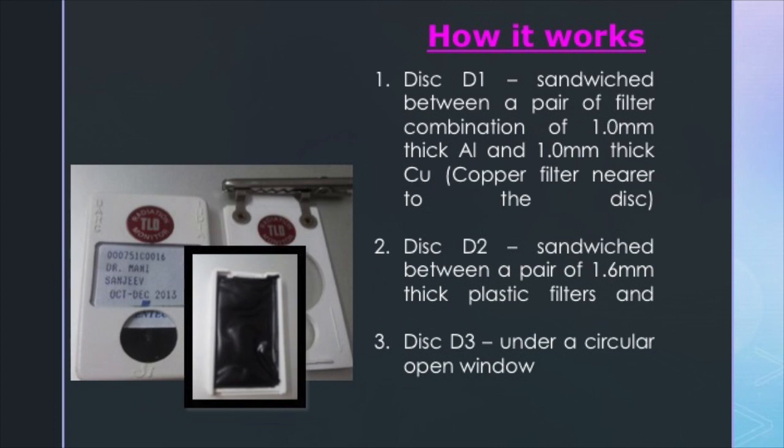The asymmetric V-cut allows the loading of the card into the plate in an exact orientation so that the discs face exactly the filters. The spot on top is the aluminum filter, one is plastic, and the third one is open — and we're going to find out why.